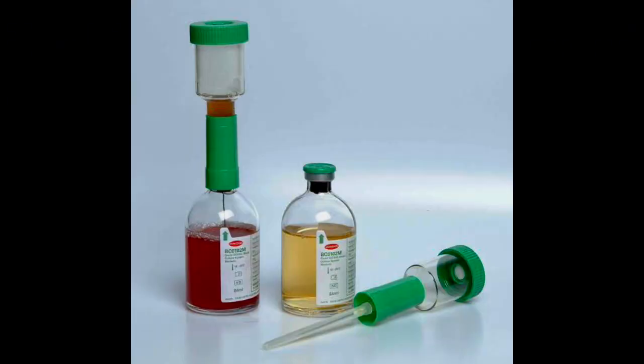The first order of draw is the blood culture bottles. These bottles are usually sterile, and the process of collection is usually sterile. It comes with its nutrient broth, and it has the aerobic and anaerobic bottles. You ought to follow the manufacturer's instructions. I'll be showing you the blood culture bottles. The one that looks bloody has been infused with blood, and the other one that is clear is without blood. Let's jump into the next one.